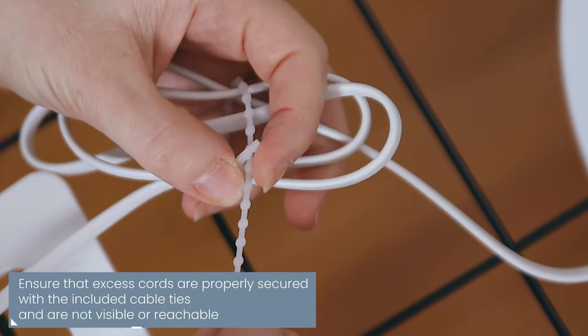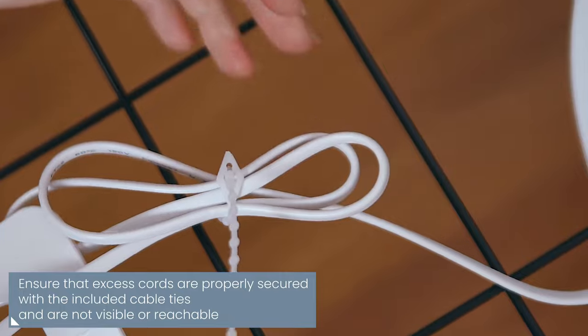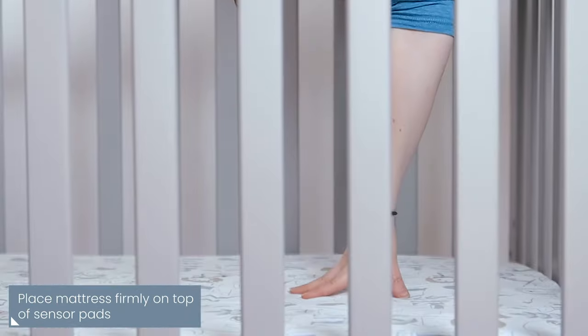Press the control unit holder or hanging hook firmly into a slot in the back of the control unit. Ensure that excess cords are properly secured with the included cable ties so your baby can't reach them. Place the mattress firmly on top of the sensor pads, ensuring good contact between the sensors and the mattress.